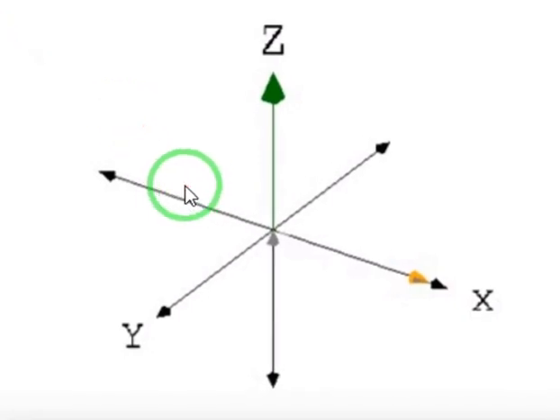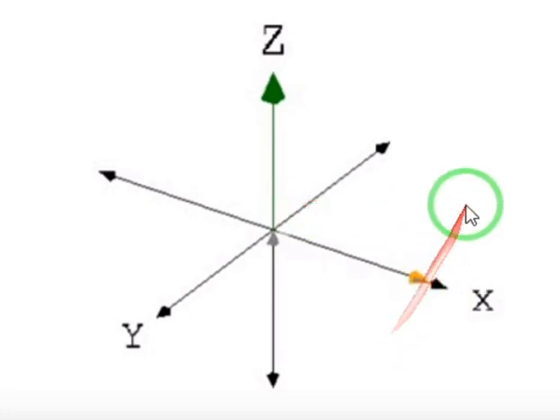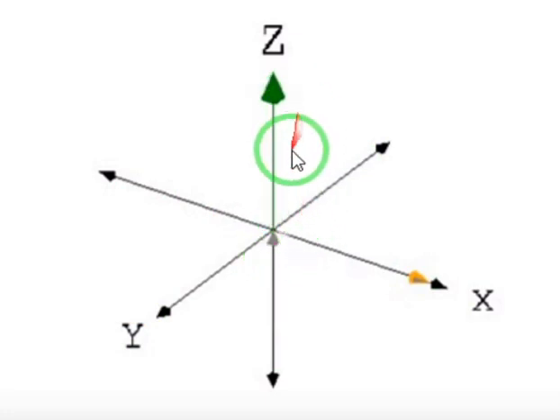And here we want to see exactly what is happening. If you consider this direction as the direction of the applied field, we want to see, when the radio frequency is applied and the magnetic spin is disturbed, the net component on the xy plane and the net component in the direction of the z axis.